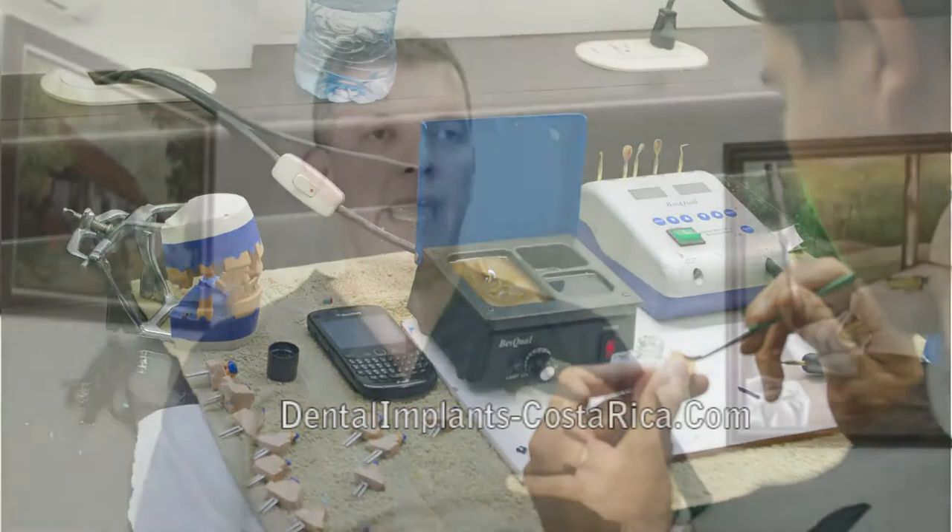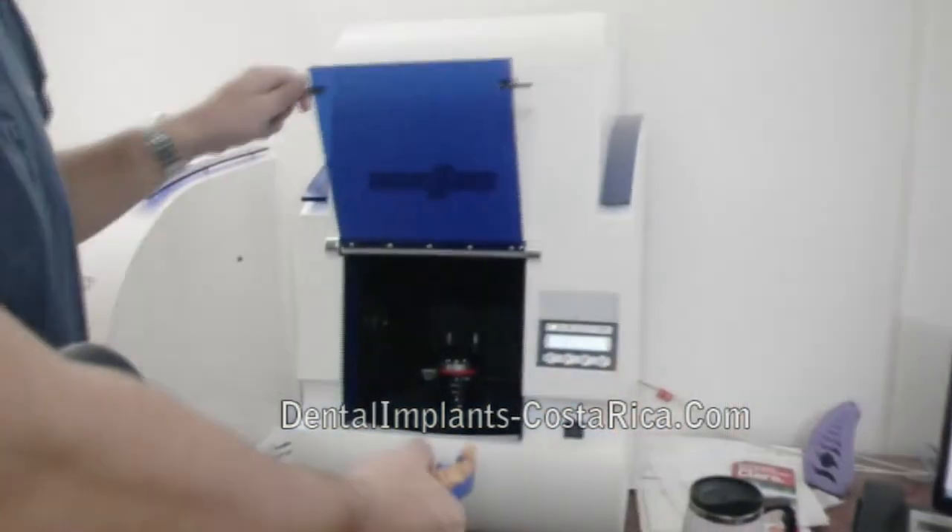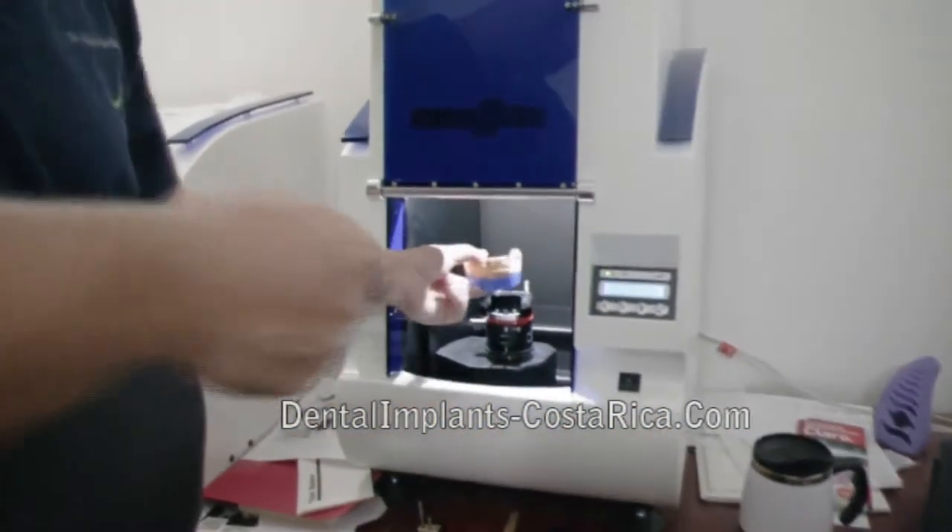We've been hiring new people who are artists — technicians that really create those smiles — and we're giving them the tools, especially new technology, so they can create better work. One of the machines we're talking about is the CAD-CAM zirconium crowns, which allow us to create through the computer structures made of zirconium that are stronger than metal and more natural looking than metal itself.